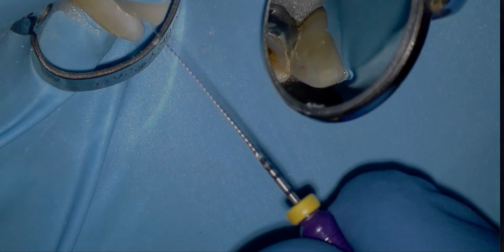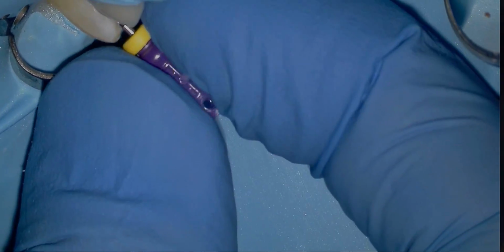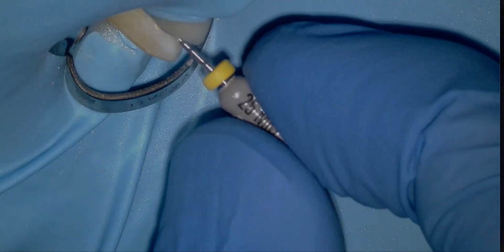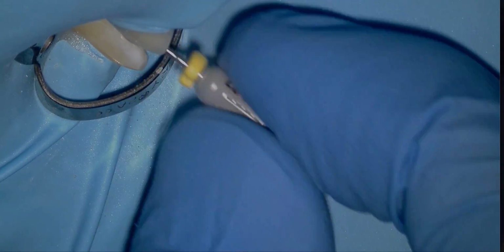Clockwise turn, pull, bite, bite, pull, bite, pull. There's just a little bit of a tug there, and now we're making our way past that blockage. Because essentially what I did was I rammed a whole bunch of dentin debris into that apical constriction, and now I gotta make my way through it. So now we're down to length. Probably we're past it. I'm gonna make sure we're past it. Taking a 10 file 2 millimeters out the apex, it's not the end of the world.